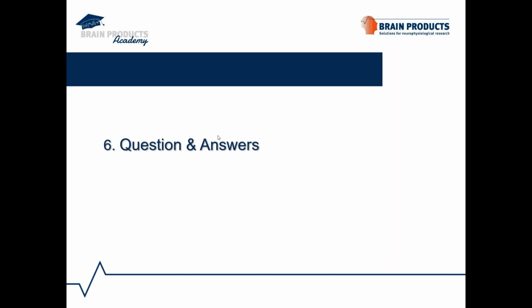So the second question is also very similar to the first one. Does the Matlab transformation also work with Octave? So my answer is still no. The answers that I gave just now hold true also for Octave.